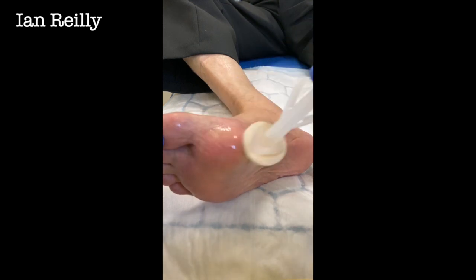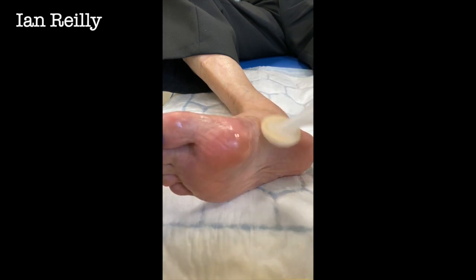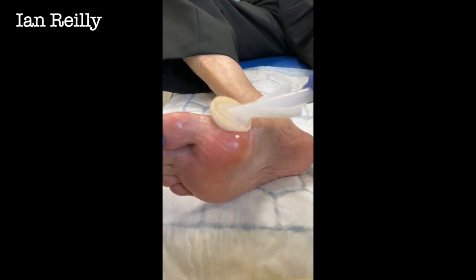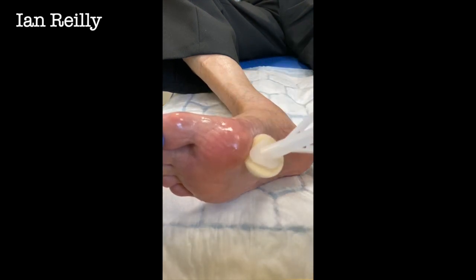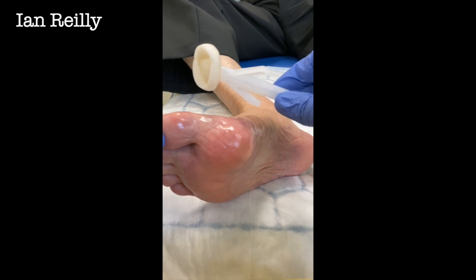The first thing we're going to do is just a little bit of skin prep - this is chloroprep. As always happens when we're doing videos somebody's going to wander in in a few minutes and the door's going to clatter, but never mind. A little bit of skin prep there, just let that dry off. These chloropreps that you've seen me use on other videos are really nice.